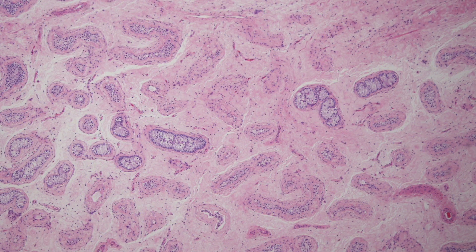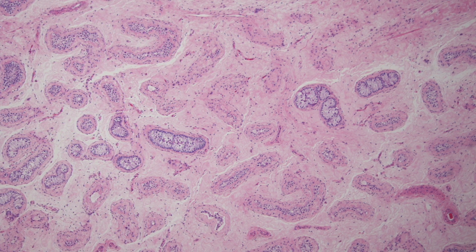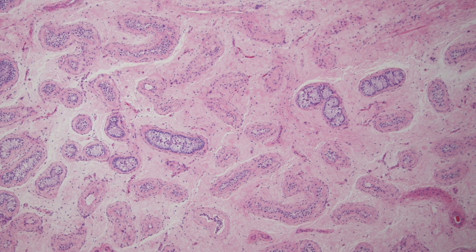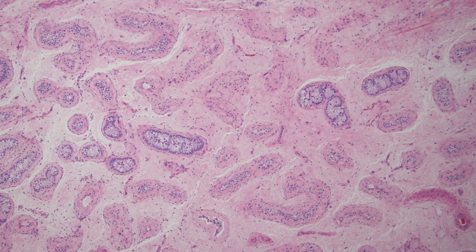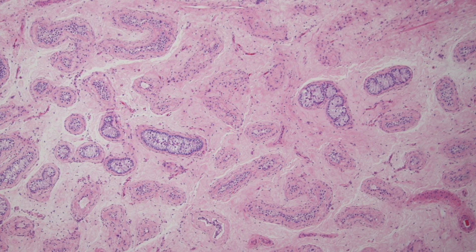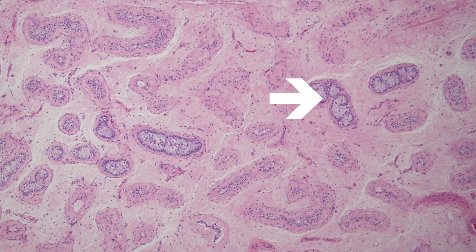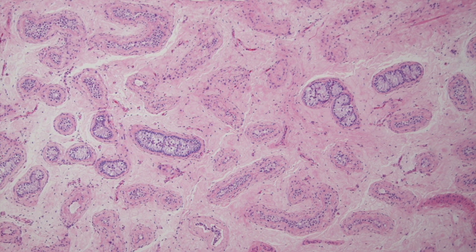In contrast, this is the histological appearance of a testis removed for gender reassignment purposes. This patient will have been on estrogen prior to surgery. The seminiferous tubules are smaller and more widely spaced with expansion of the interstitium. There are tubules containing Sertoli cells only, and an obvious feature seen is the presence of peritubular fibrosis.